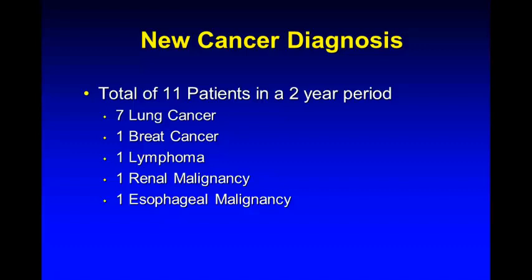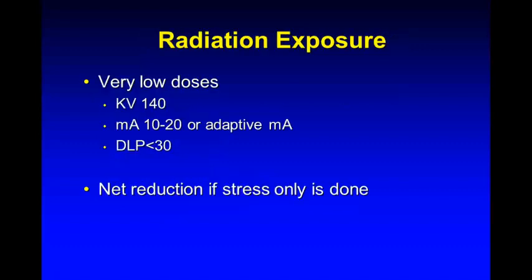You're going to miss the small lung nodules. We always discuss these: what shall we do with them? And we face it all the time with the cardiac CT program that we do, but I think this is an important issue, that you need to look at these CT attenuation corrections.